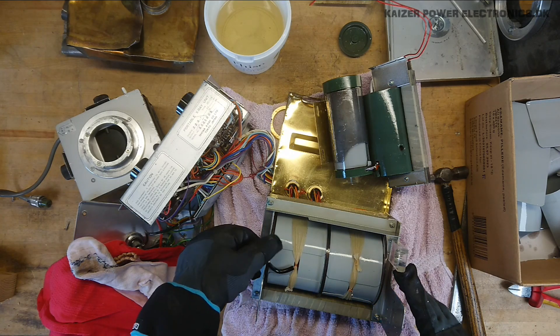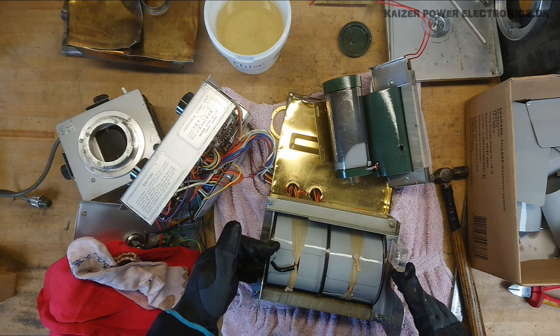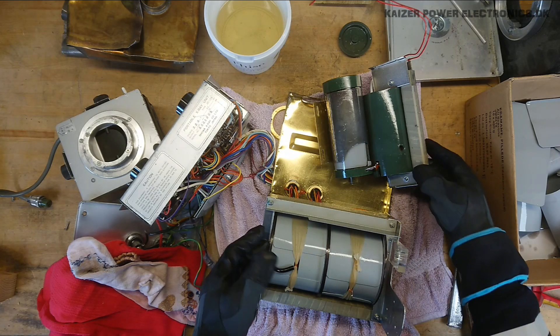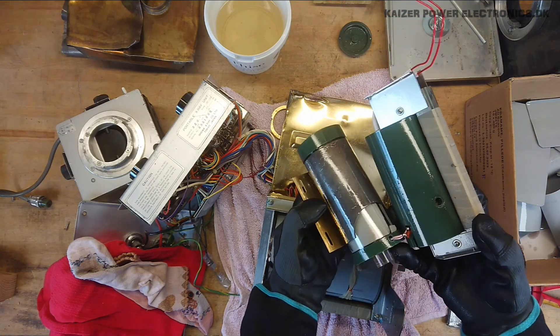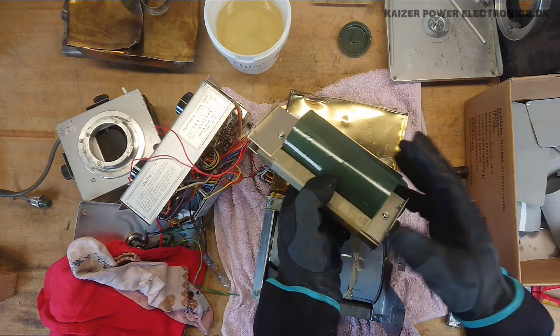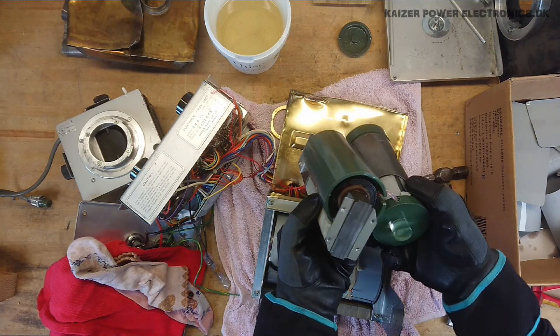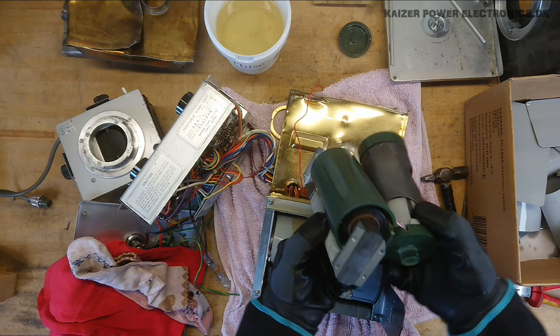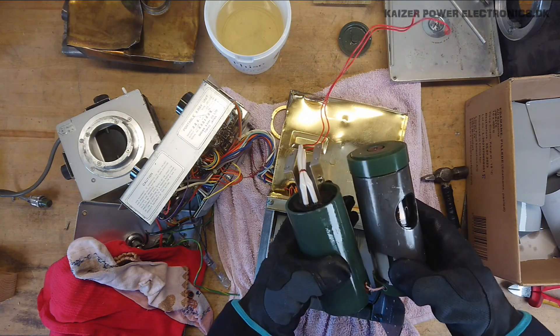This one was the anode connection for the x-ray tube. Then we have the other end over here which goes into the cathode. The filament transformer is basically a step-down transformer — again, mains iron core. And as we can see in here, some very thick copper wire on the inside.